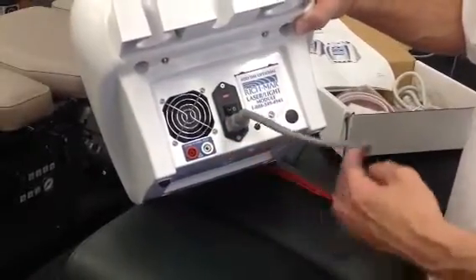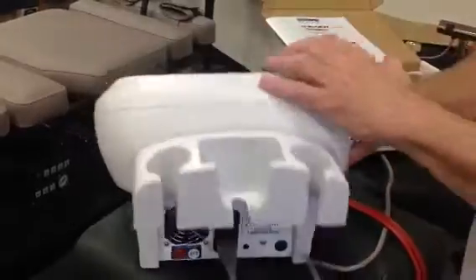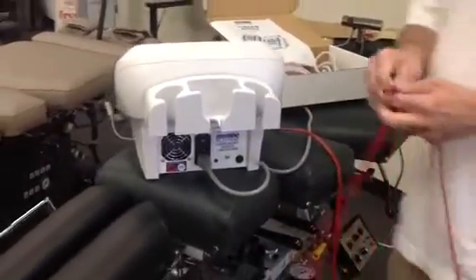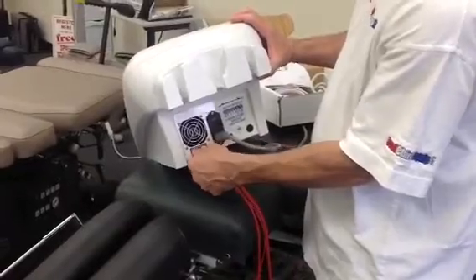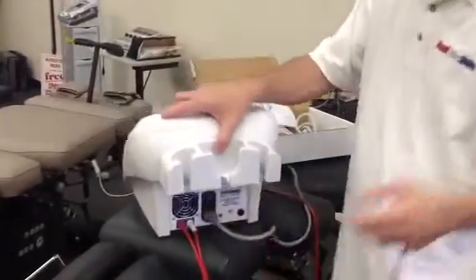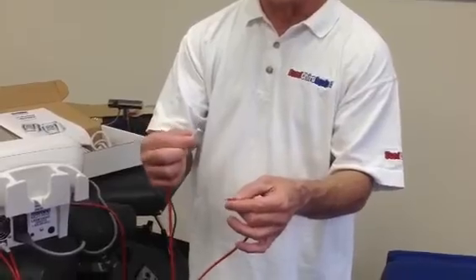I am going to show you the lead cord test. The machine has to be on for the lead cord test. You very simply plug in. It doesn't matter whether the red goes in the white or the white goes in the red. It only matters that you actually get them in there. Then you take your lead cord and put it together, and you're looking for that sort of noise.